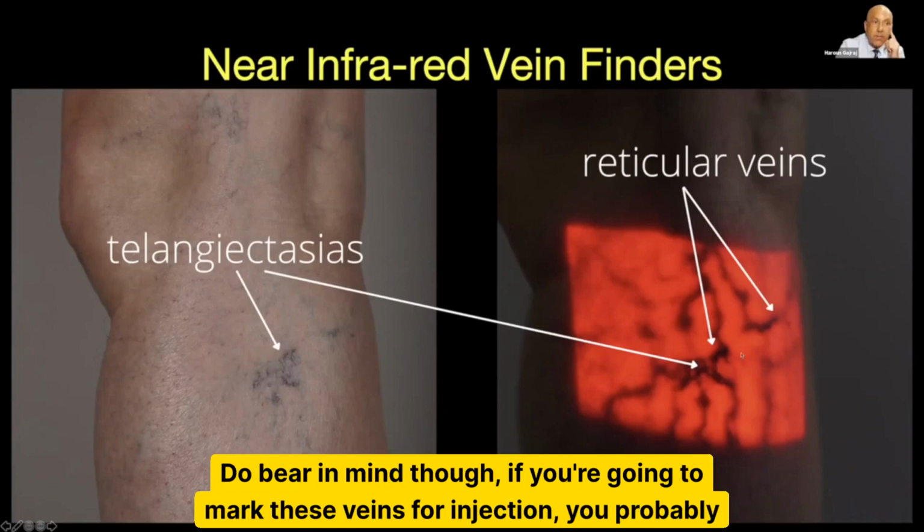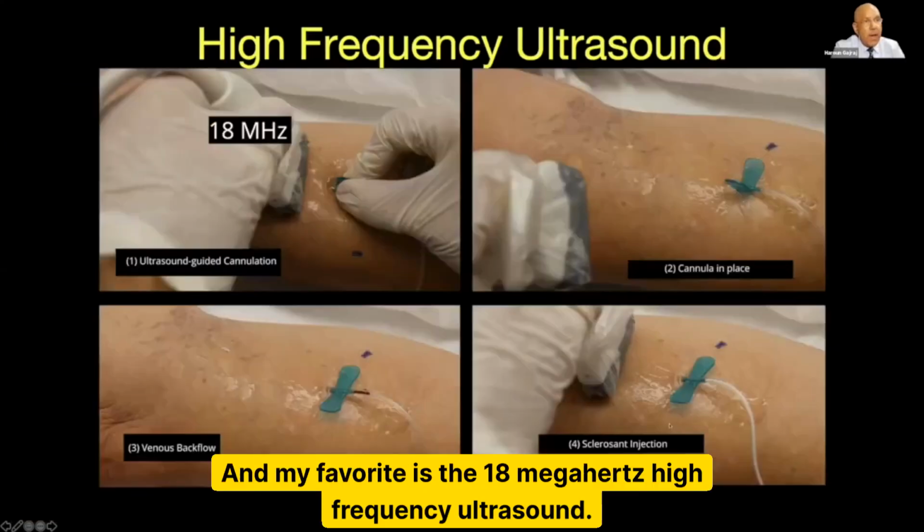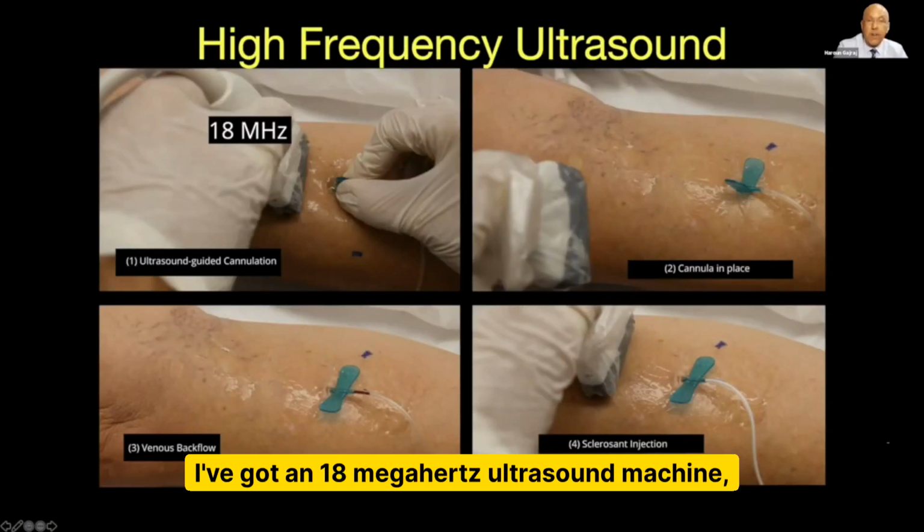Do bear in mind, though, if you're going to mark these veins for injection, you probably ought to lie the patient down to mark them rather than mark them in the standing position. And my favorite is the 18 megahertz high frequency ultrasound. I've got an 18 megahertz ultrasound machine and I use it every day.